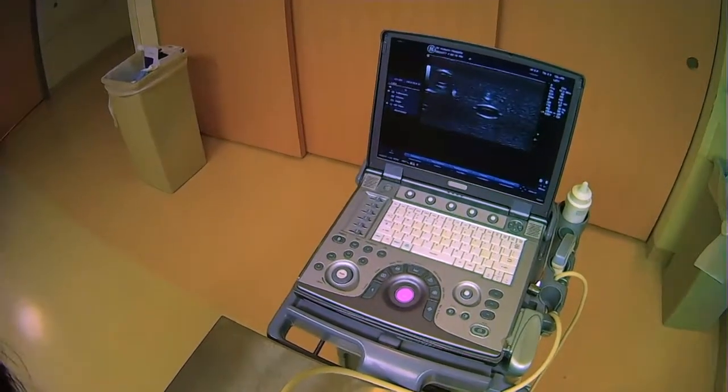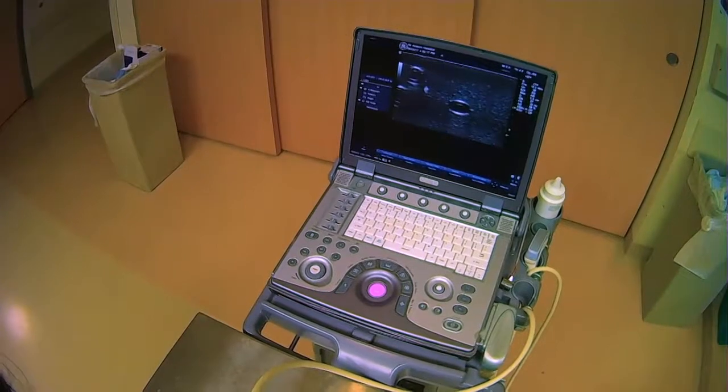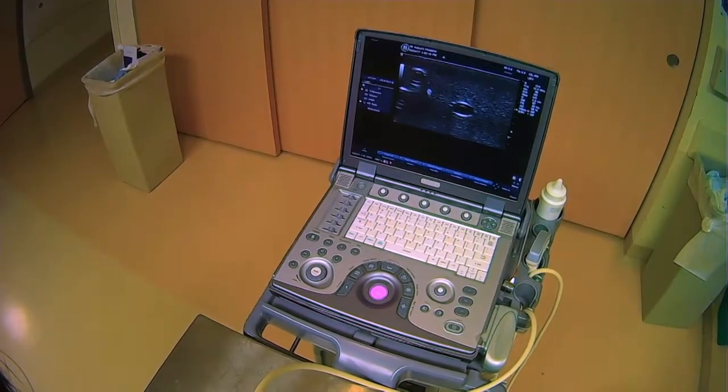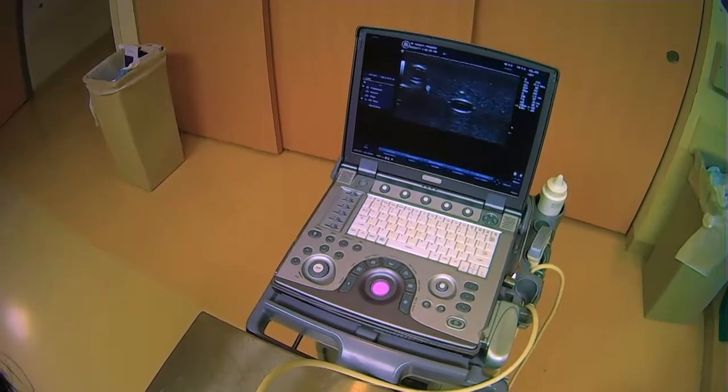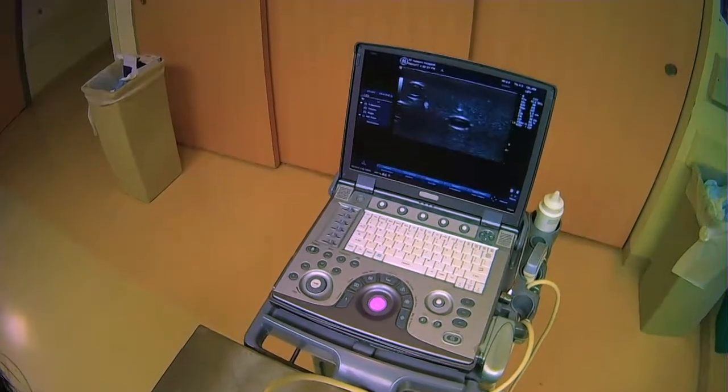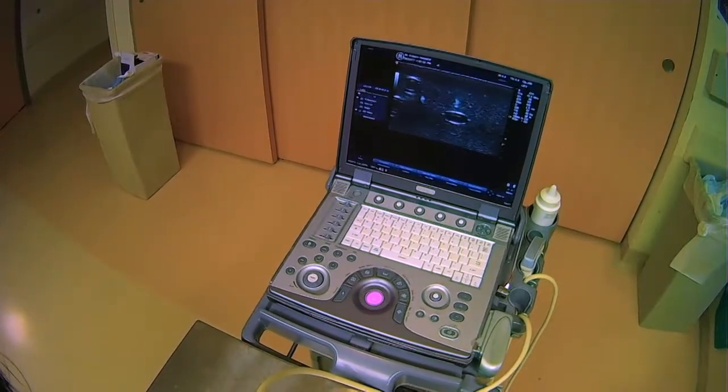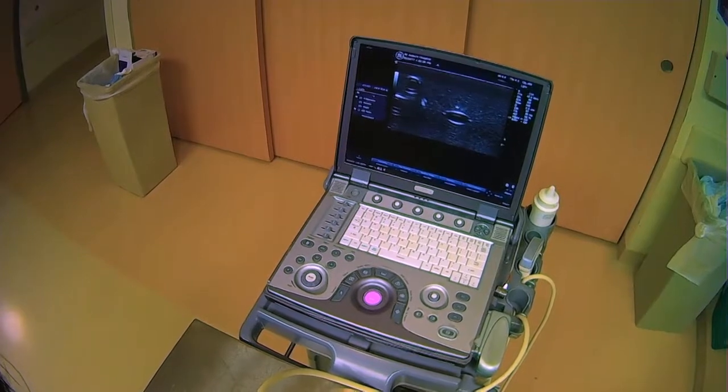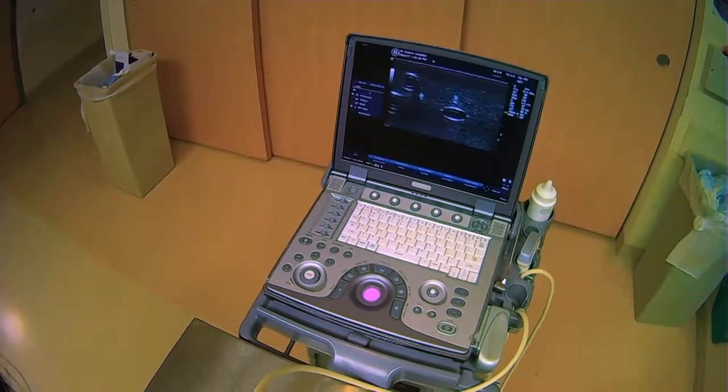But what I want you to appreciate is that it takes some time before you start seeing that needle tip. So again I'm inserting it but it's not until I get right next to the vessel that I start to see the actual tip of the needle.